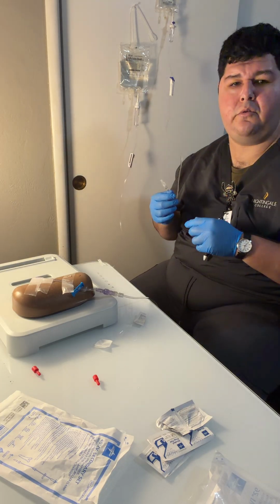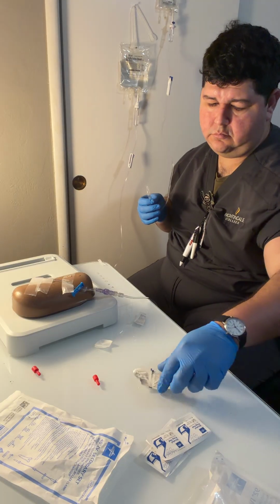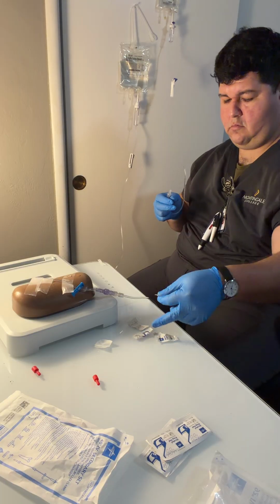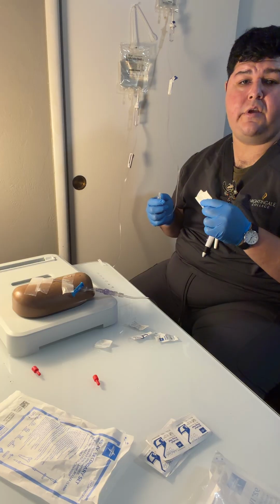Once it's bled, we're going to close the roller clamp, and then we're going to take a new alcohol prep pad. And then we're going to take our Y site and clean the site with our alcohol.